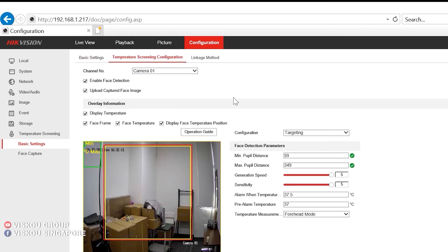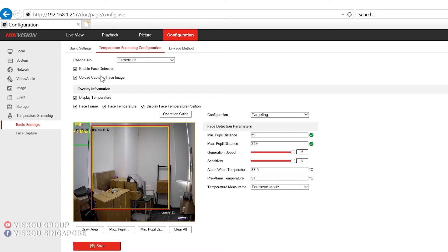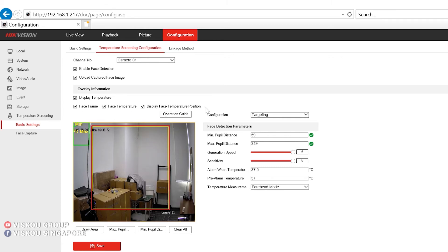Under here, you can enable face detection. First, display temperature, the face frame, face temperature, and also display face temperature positions.